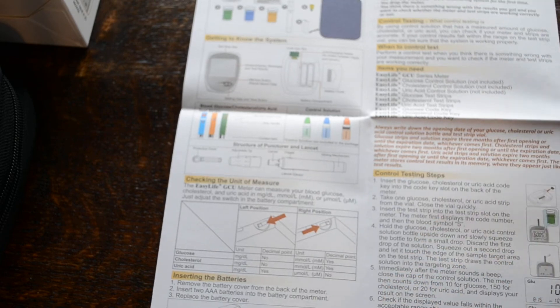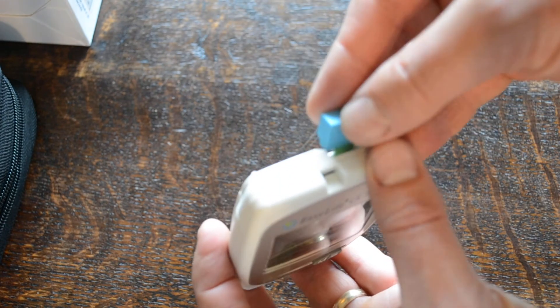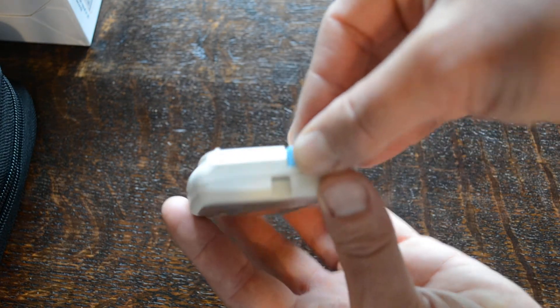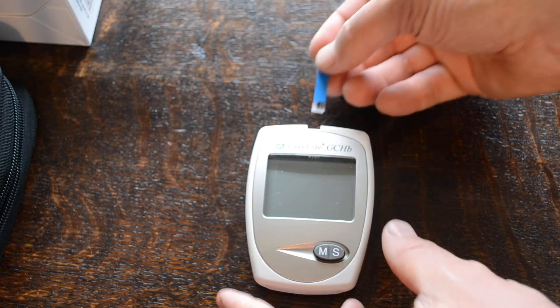It tells you how to set the time and date up and how to perform a test. So a very good set of instructions and all the test strips that you require. You get a code chip for each set of test strips which goes into the top slot on the back of the meter, and then basically you're ready to go with the correct test strip and the code chip.